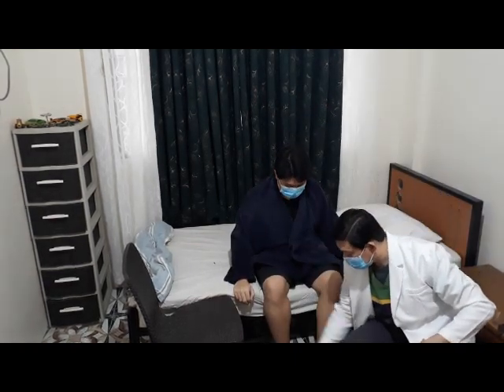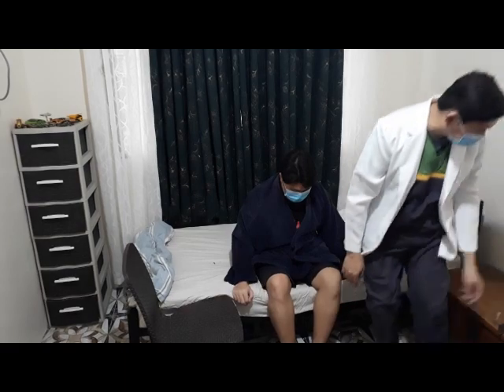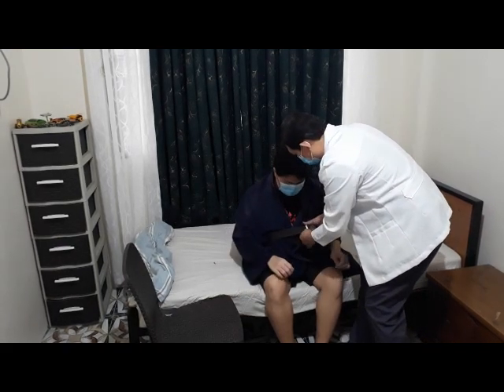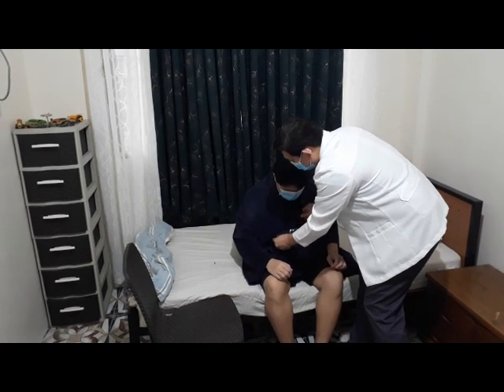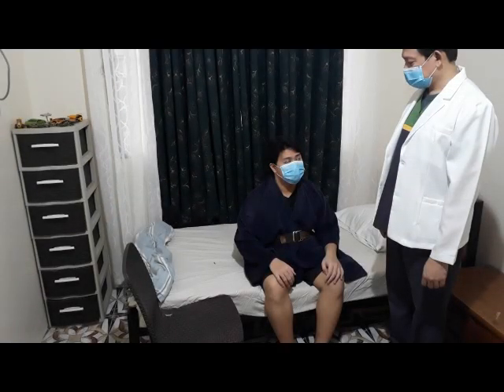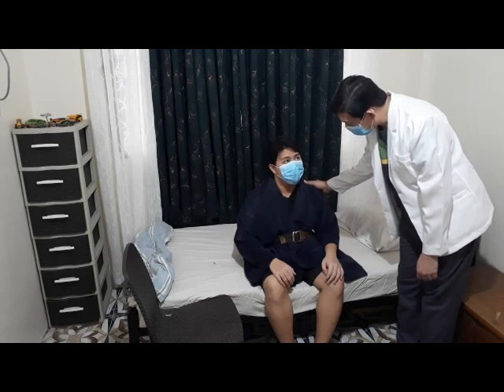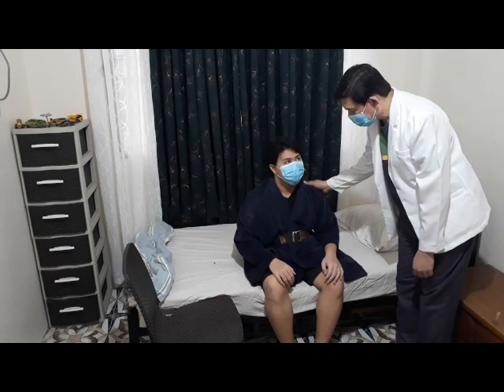Place a transfer belt snugly around client's waist. Are you feeling alright? Yes. Give explicit instructions to the client. Ask client to do the following. Sir, you follow my instruction? Yes. Move forward and sit on the edge of bed with feet placed on the floor.